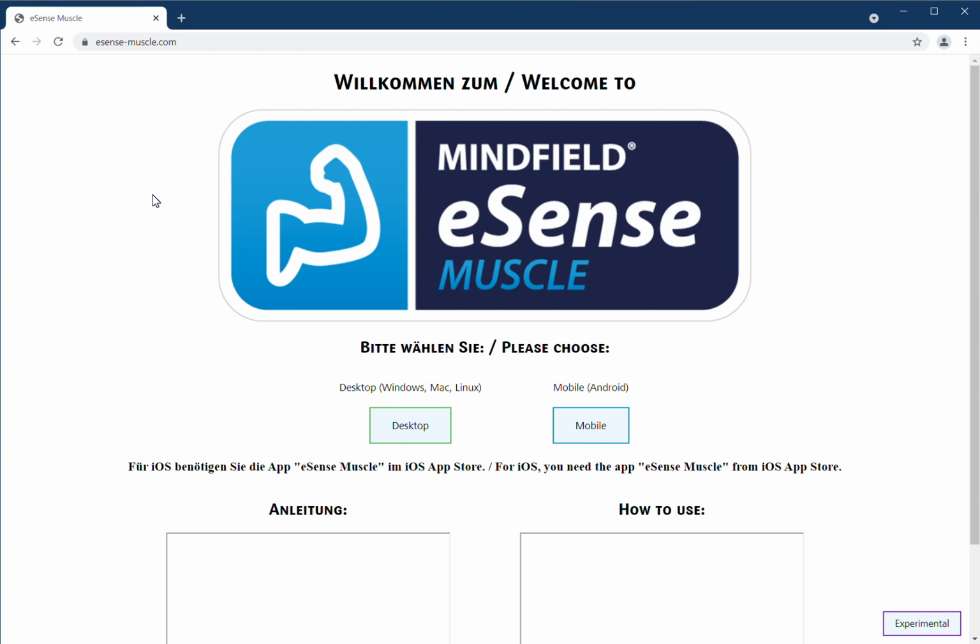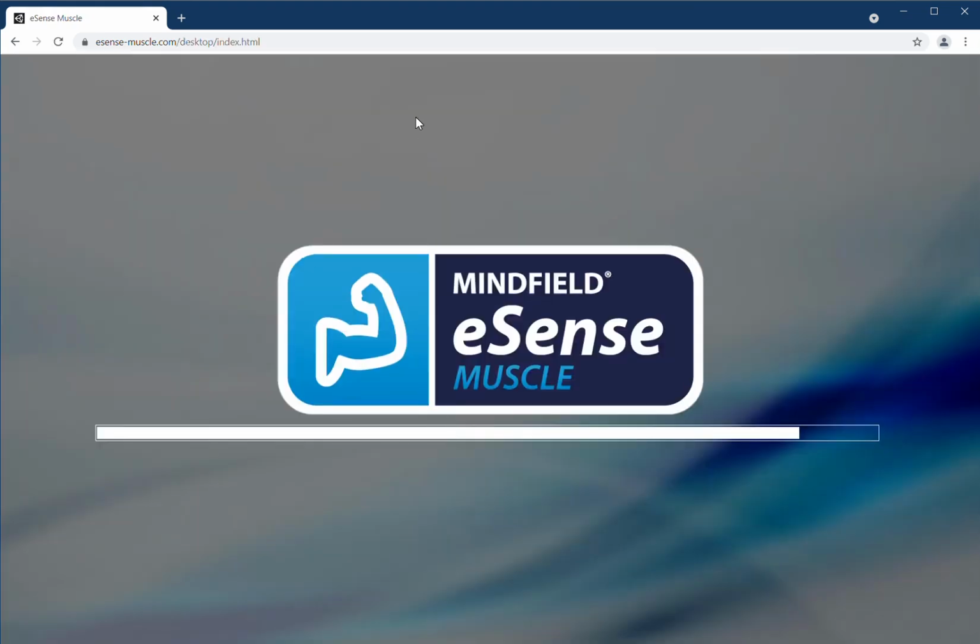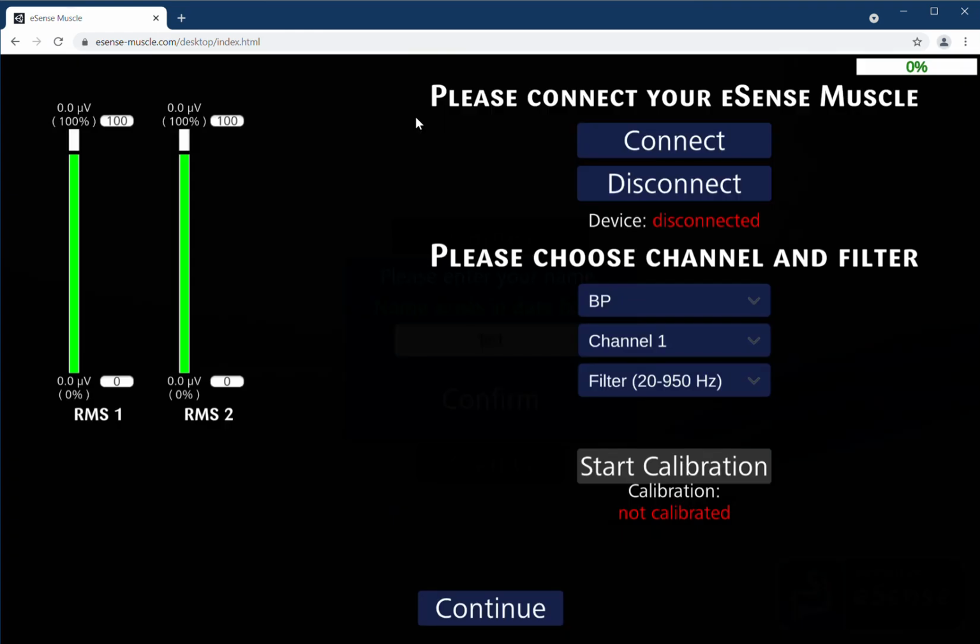So here now in this video, I would like to demo you the desktop version. I would like to demo you how to use it under Windows. So I'm recording this video now under Windows on my computer where I have Bluetooth ready. And so now I click here on the desktop build icon. So now it's starting the web app, and web Bluetooth means that the Bluetooth connection is directly established between the eSense muscle device and your web browser.